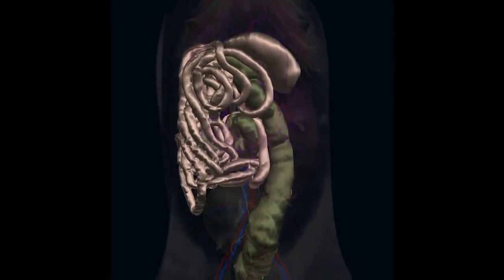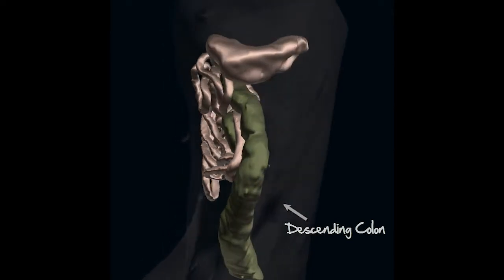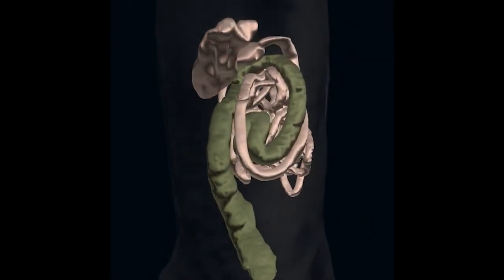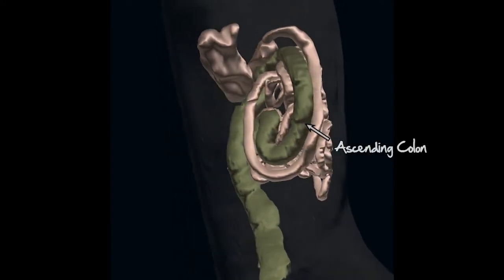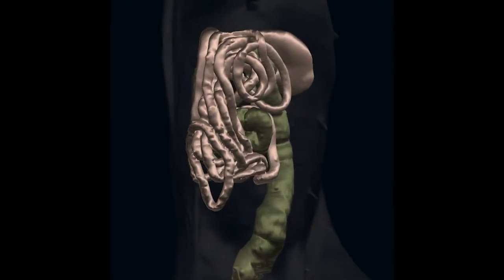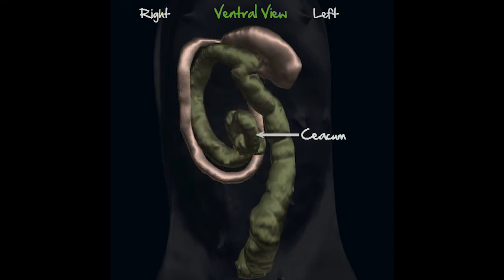The colon is divided into three segments: the descending part, located along the left side of the abdomen, the transverse colon, which extends crosswise just caudal to the stomach, and the ascending portion on the right. The cecum is located at the ileocecal junction. In dogs, this segment is fairly large, sigmoid, and normally filled with gas, partly encircling the ileocecal valve, but in cats, it is small and typically free of gas.